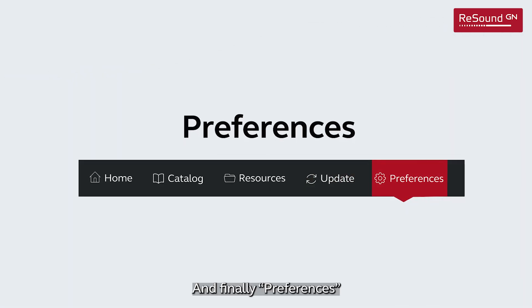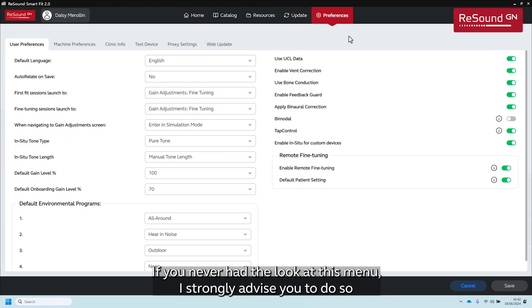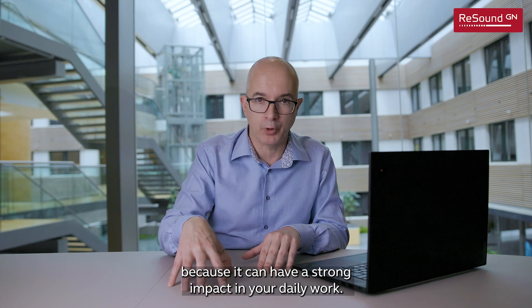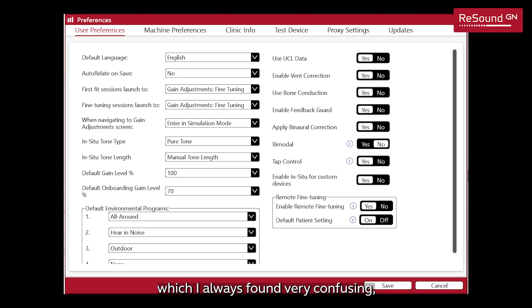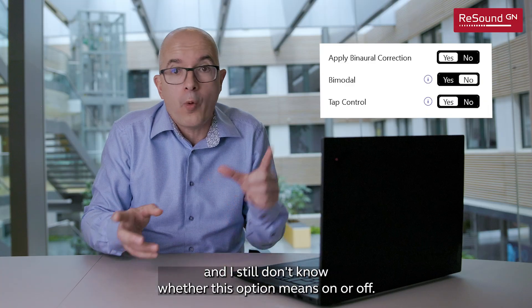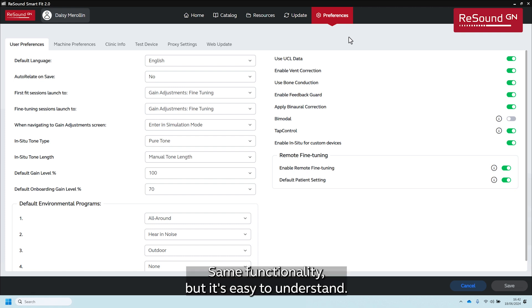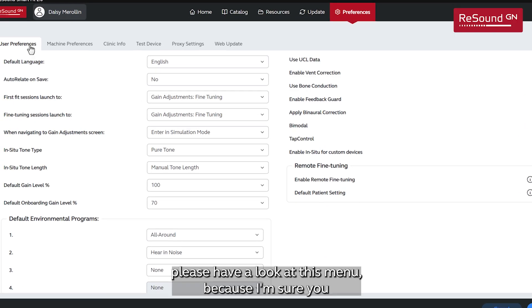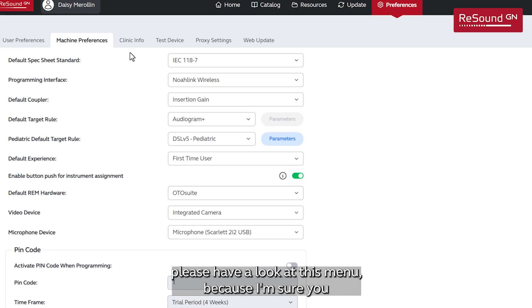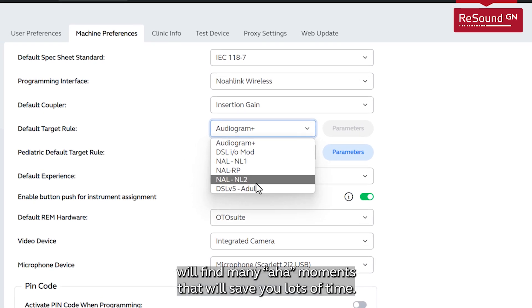And finally, Preferences. If you have never had a look at this menu, I strongly advise you to do so, because it can have a strong impact on your daily work. This is how it looked in previous versions — always very confusing, and I still don't know whether an option means on or off. And this is how it looks now: same functionality, but easy to understand. Please have a look at this menu because I'm sure you will find many aha moments that will save you lots of time.